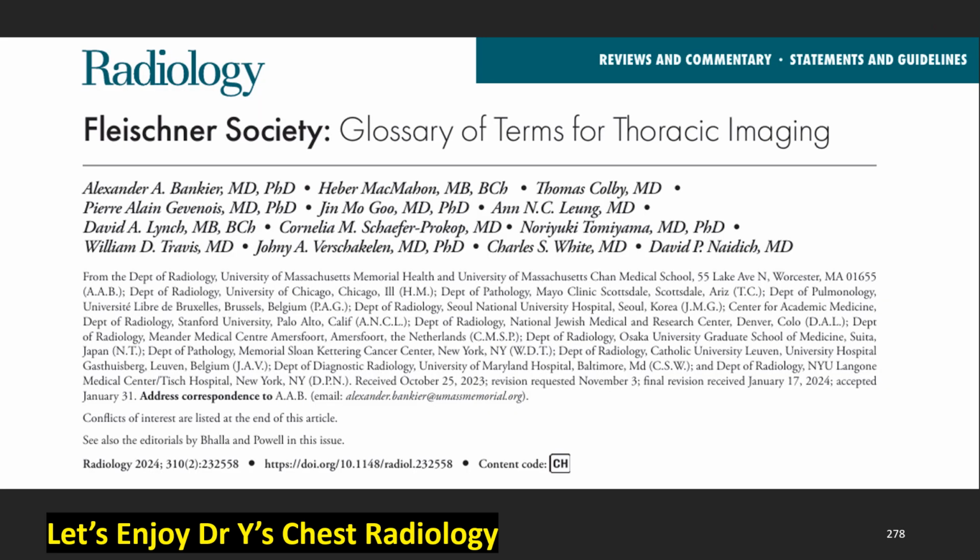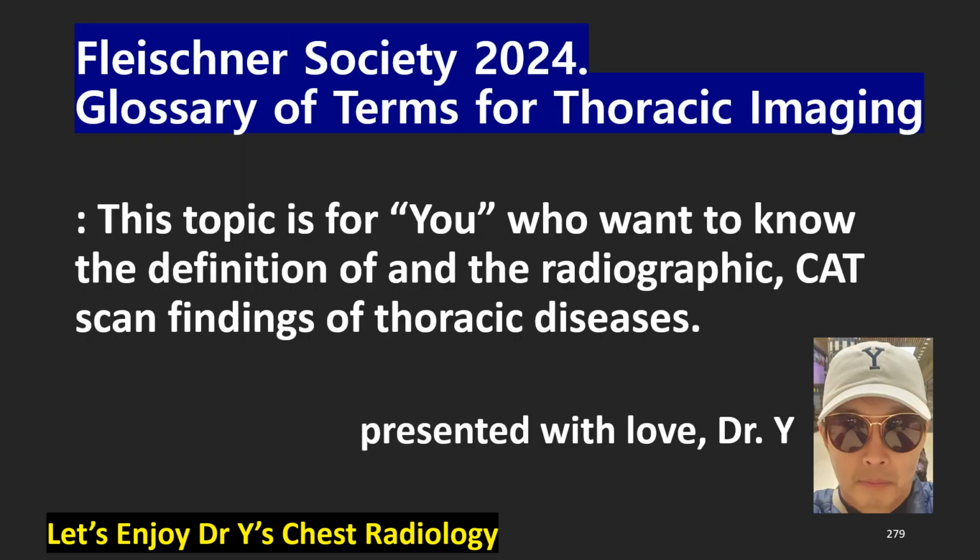This topic is based on the Radiology reviews and commentary, statements and guidelines, Fleischner Society glossary of terms for thoracic imaging by Alexander A. Bankier et al., Radiology 2024, 310. This topic is for you who want to know the definition of and the radiographic and CT findings of the thoracic diseases.